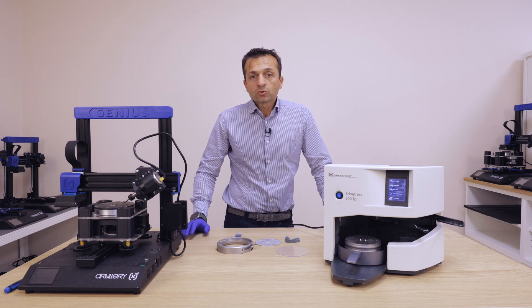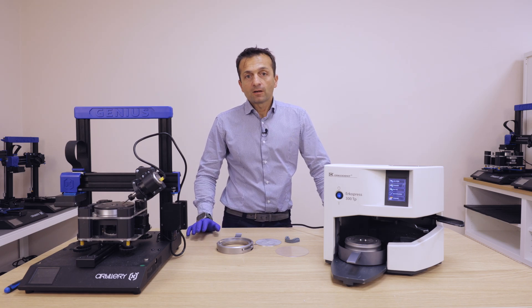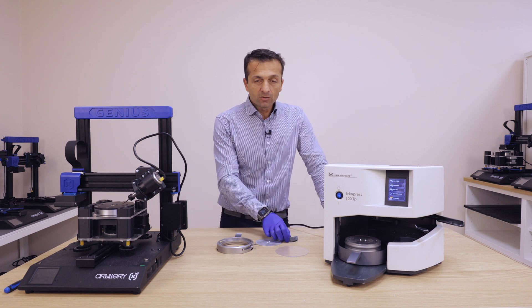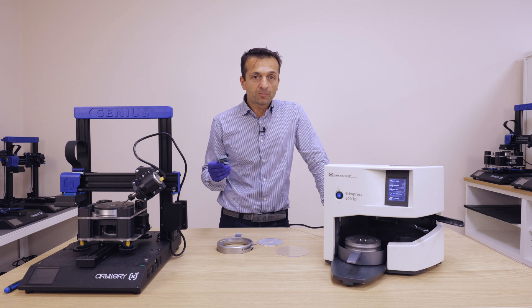Hello everyone. Today I want to show you how to do the thermoforming of your model after you 3D print it.